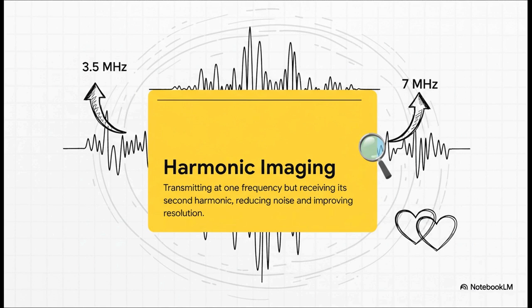So what's the big benefit? It cuts down on a ton of noise and artifacts, especially in that near field we talked about. The result is a much cleaner image with way better definition of the endocardium. Honestly, it's a button you'll almost always want to have turned on.